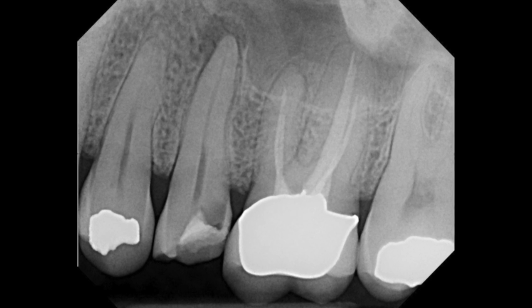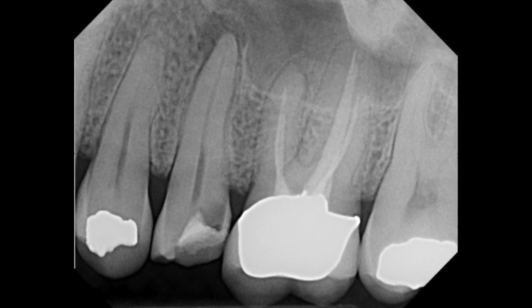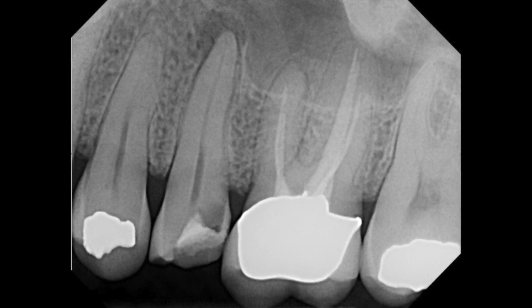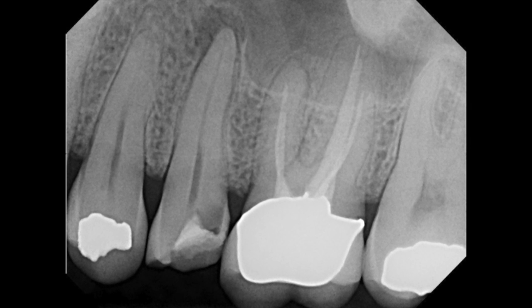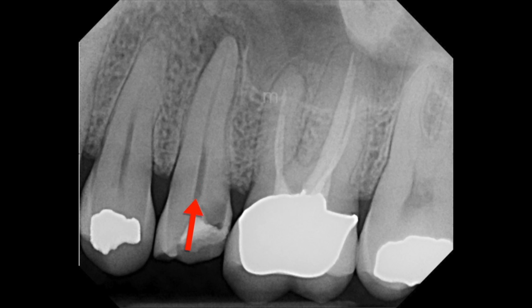The case that I have for you today is again a basic maxillary premolar. This is a second premolar, tooth number 13. As you can see, the tooth is necrotic and it has a large carious lesion in the distal part. There's a periapical radiolucency present as well. And what we decided to do was to do a root canal on this tooth. And we always, as usual, start the case by getting an estimated working length using our digital radiograph. Pre-estimated length on this tooth is a 19 millimeter root.